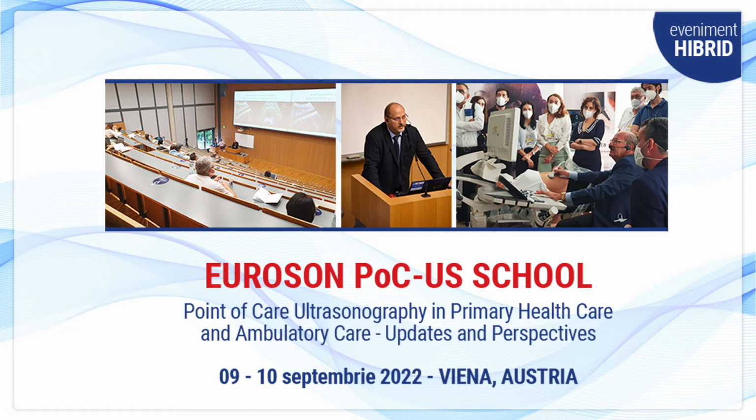Good afternoon, ladies and gentlemen. The topic of the last lecture is thoracic ultrasound. The thing is that before we start, we need to somehow understand what is hidden behind the phrase thoracic ultrasonography. Well, let's try to look at this part of sonography, dividing it into three parts: chest wall, supraclavicular fossa, and lung sonography. So those are the three parts of thoracic ultrasonography: chest wall, supraclavicular fossa, and lung sonography.